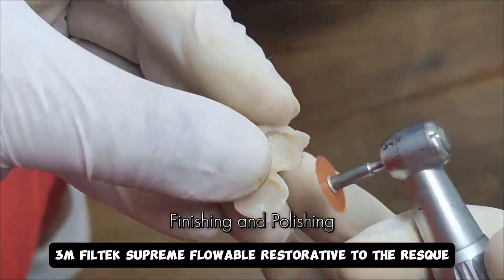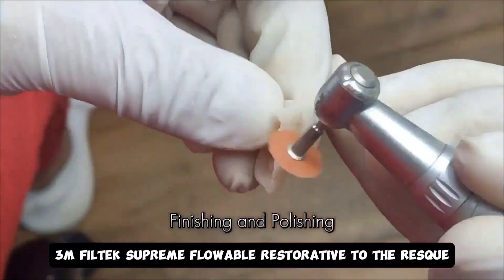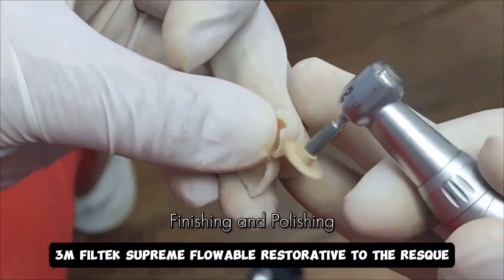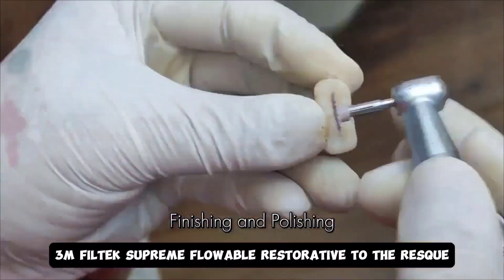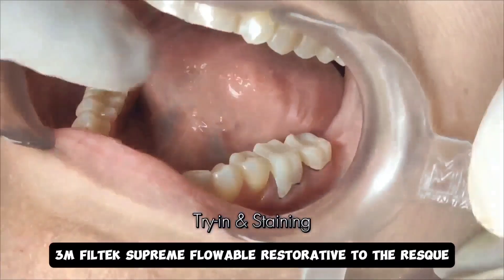What I am using here is a coarse soft flex disc, which is then followed by the beige color spiral that you see on screen right now. The next increment would be the use of the pink or the purple spiral, which is diamond impregnated.